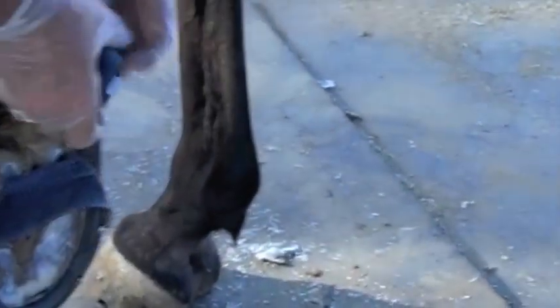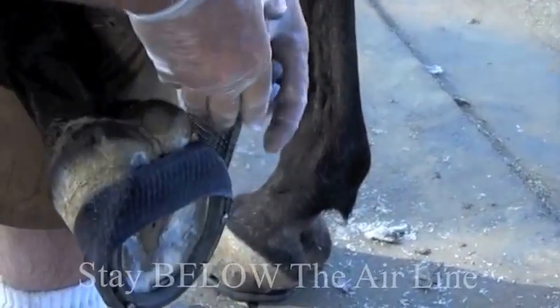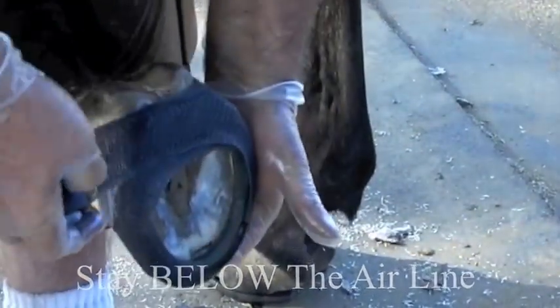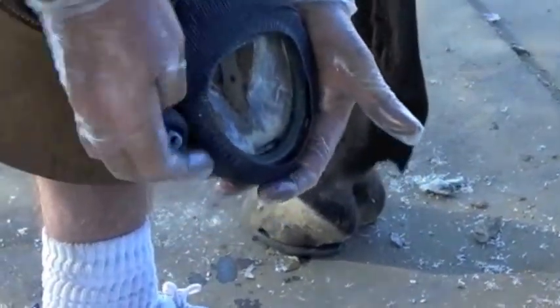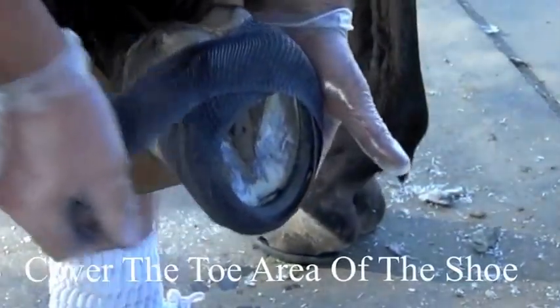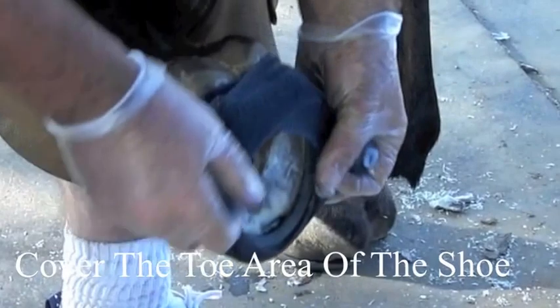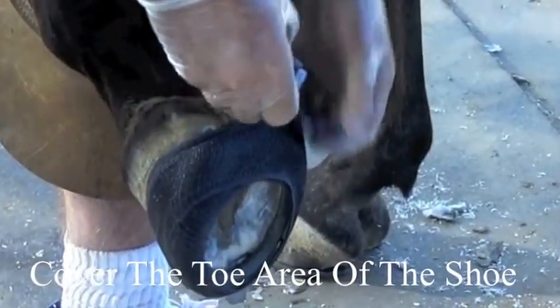In the casting process, it's very important to alternate between the heels — going high on one side and low on the other. In this video you'll notice I'm going high on one side and then dropping down and going low on the other side. I refer to it as the cross your heart bra: going up on the medial heel and then down on the lateral side, up on the lateral side, down on the medial side. By alternating back and forth, we're trying to avoid pinching the bulbs.